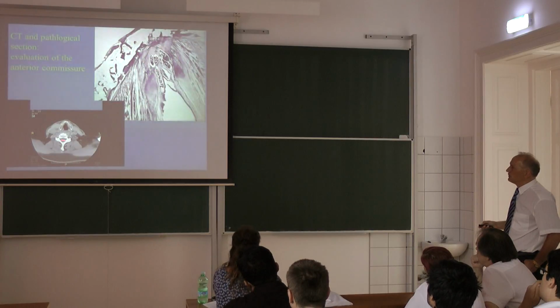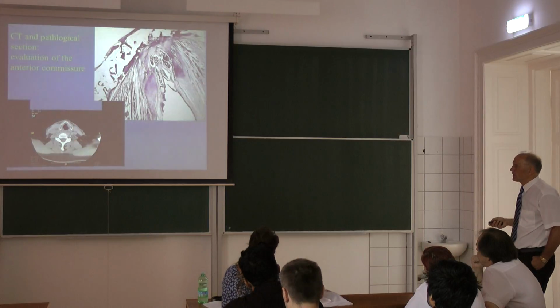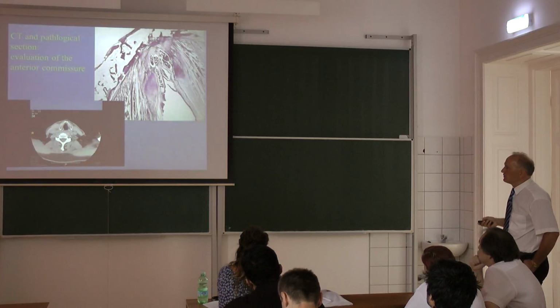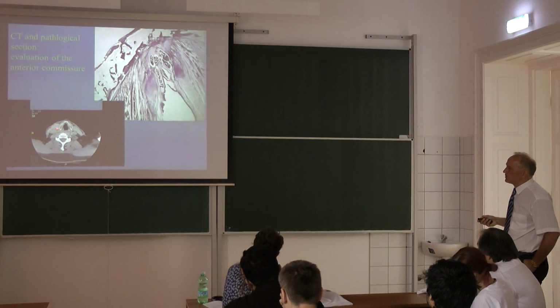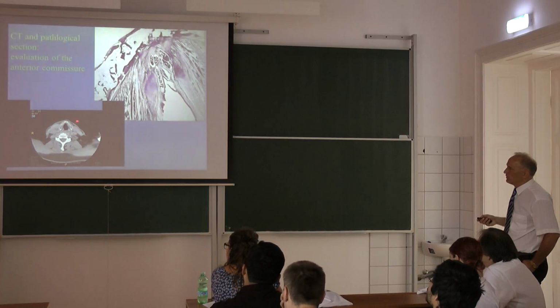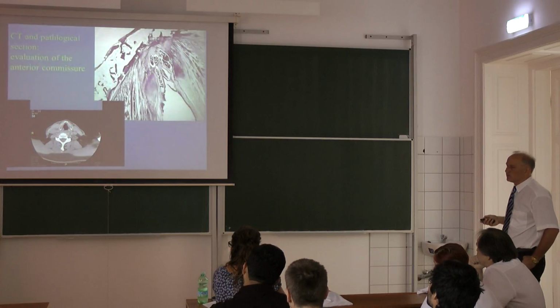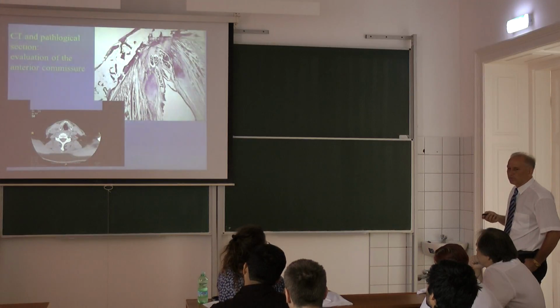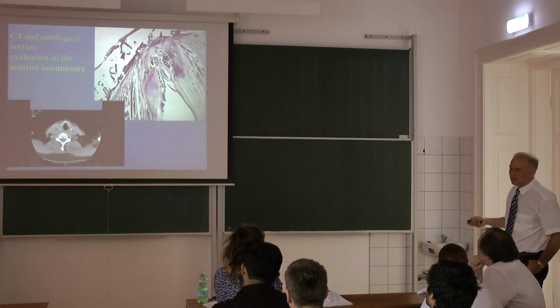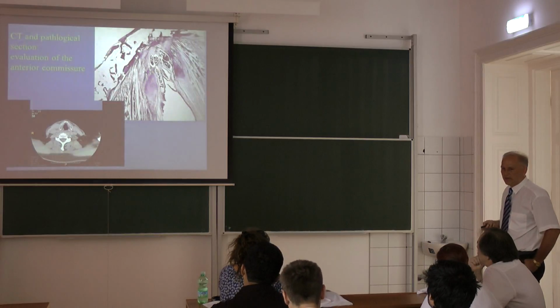That might be staged beforehand and diagnosed by CT scan, the imaging techniques. If we consider laser treatment, we have to look at the borderline of the larynx. You see the thyroid cartilage, but the tumor infiltrates the thyroid cartilage. The laser is not applicable anymore because of the infiltration, so we have to change to external approach surgery to resect the entire cartilage of the larynx as well.